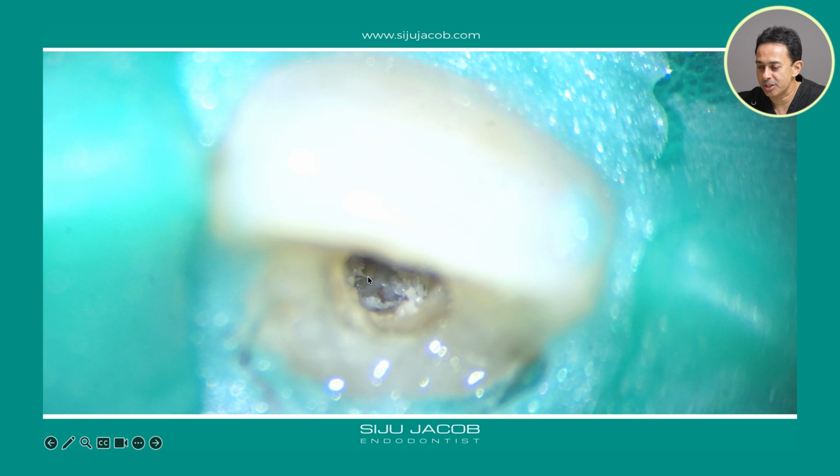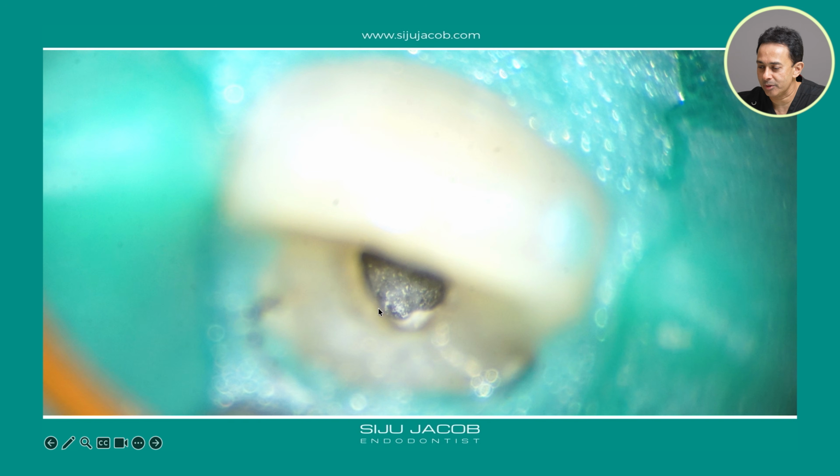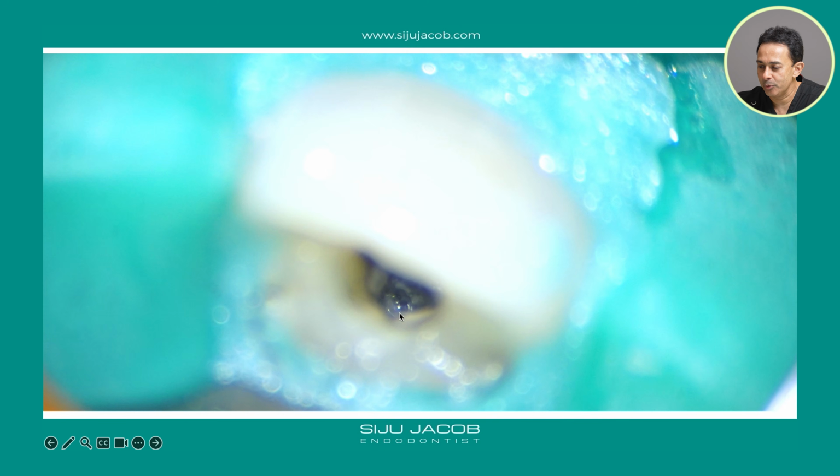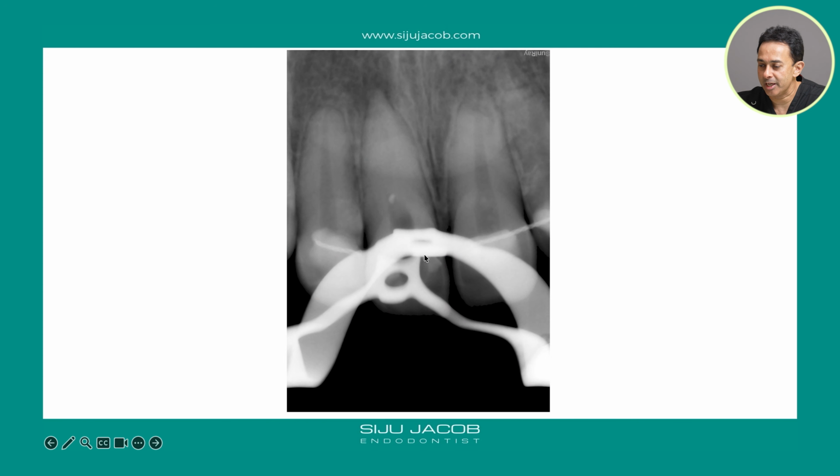So whenever we are stuck, what I do is I put a little bit of gutta percha there. You can see this part over here. I put a little bit of gutta percha into this area where I'm drilling and I'm not really sure which direction I am going in. I put a little bit of gutta percha there and then I expose the radiograph.